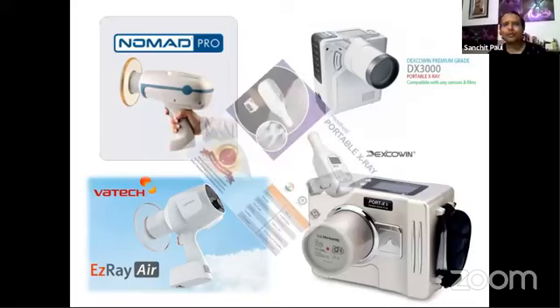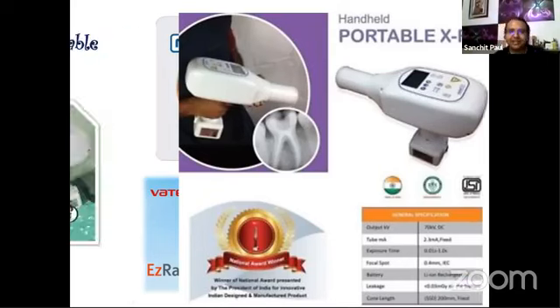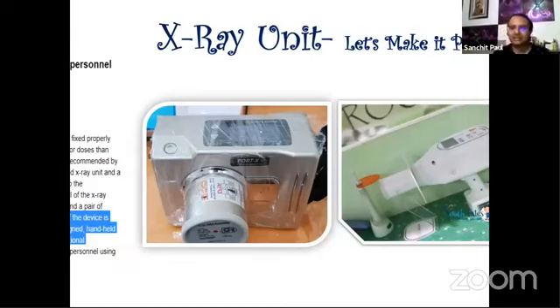So again, we want to highlight that this is important to use, especially because young children cannot really stick to the handheld or the wall-mounted X-rays. We personally use this machine from Elario. This is a made in India product, which works really well. Dr. ABHISHEK has the Genoray over there. Again, it's important to use it, so as to make sure that we take X-rays at each and every step.